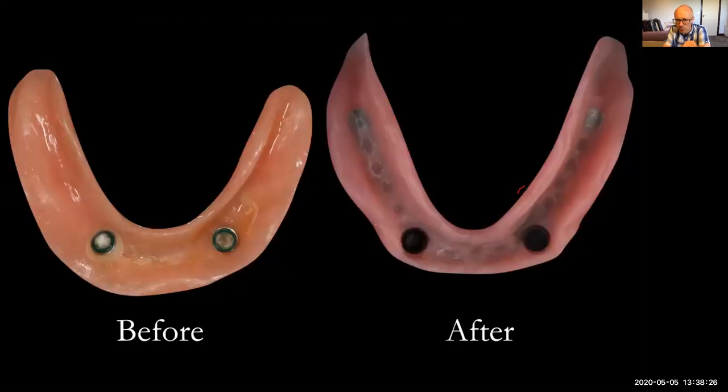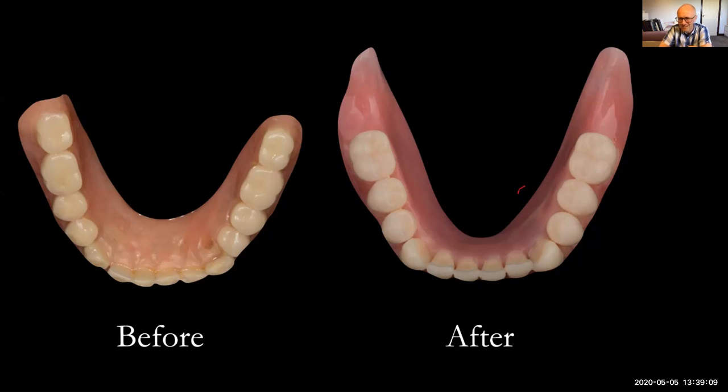But before I look at the upper with you and explore that, this is the difference in shape. And with all of the webinars that I'm doing, I'm wanting to imprint a really good denture shape in your minds. So when you go back to work, you know what a good shape is. So, it's just molded beautifully by the patient and fully extended at the retromolar pad. So this type of denture is so much better supported. And you can also see we've got that reinforcement of the metalwork inside too. So let's just flip them over. Totally different shapes.